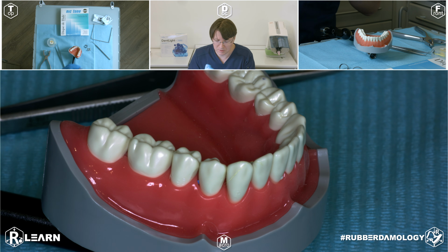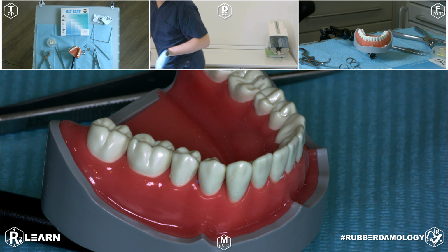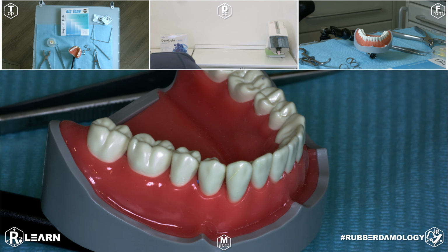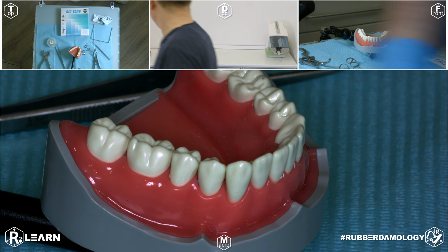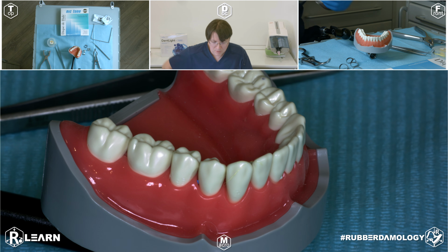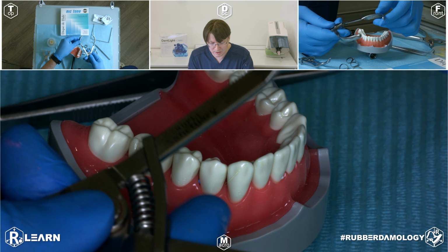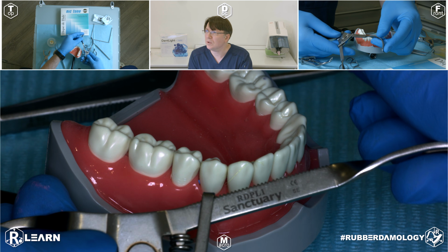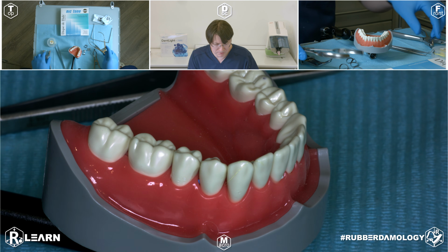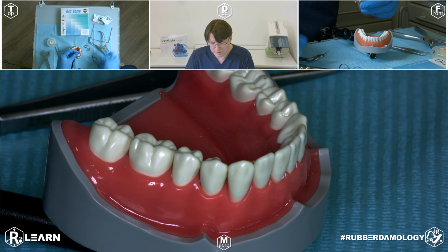Oh, sorry. I replace my instrument. This set of exercises we made with the Sanctuary dental instruments and the clamp for incisors.